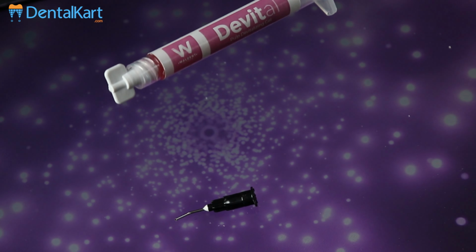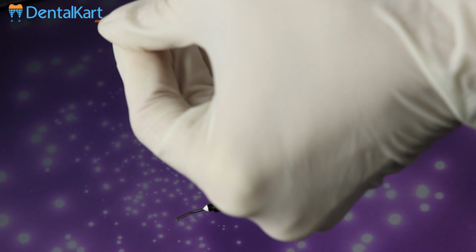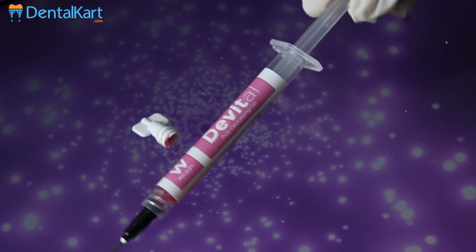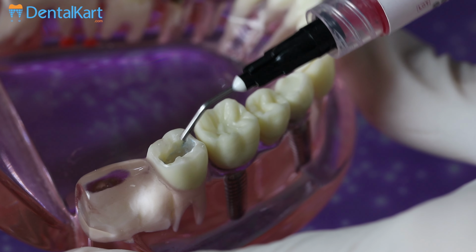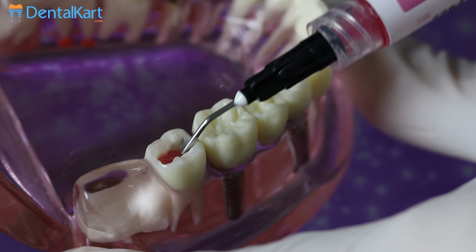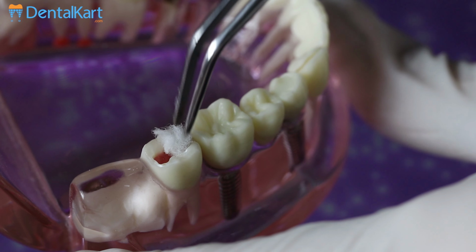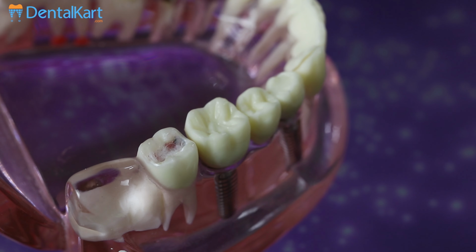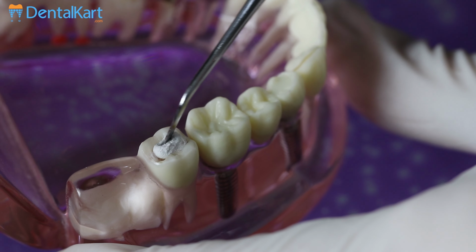For Waldent Devital Pulp Devitalizing gel application, attach the dispensing tip to the gel tube and eject a small quantity of gel directly inside the access cavity. Then insert a cotton pellet over it and seal it hermetically with temporary restoration.